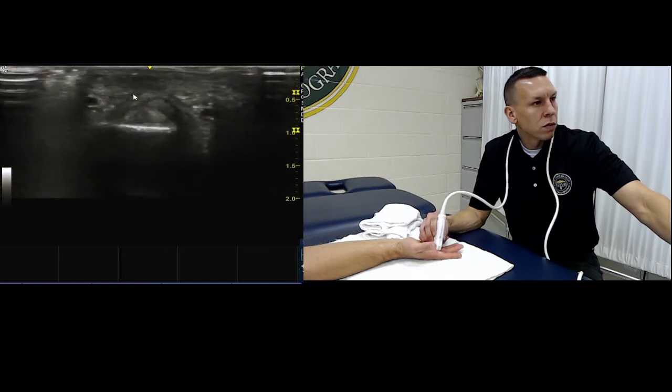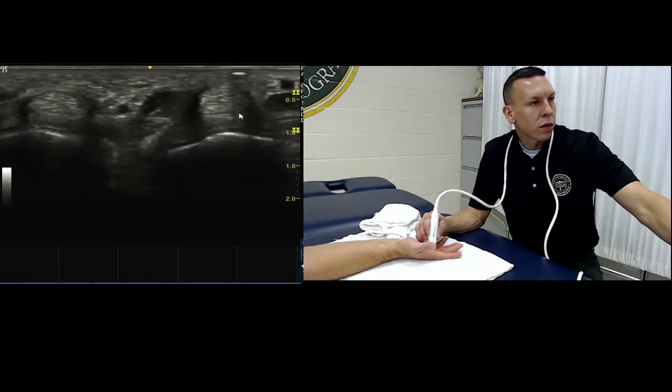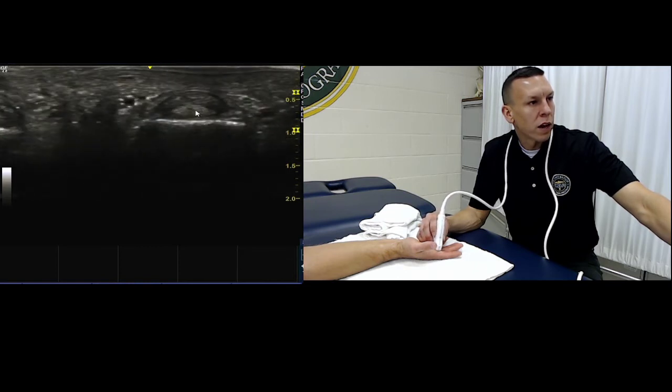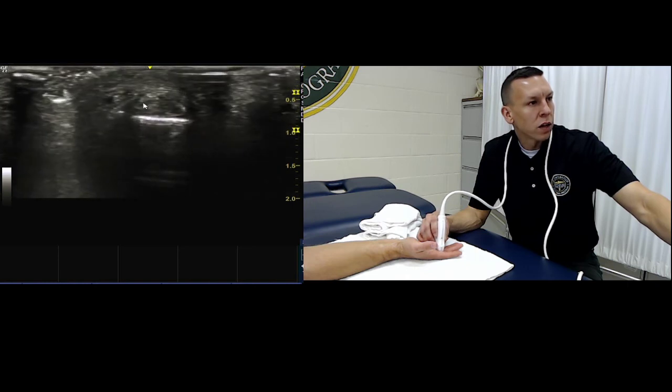Let's go back here. We'll do that again. Here we see the two, right above each other, 1 and 2. They're going to smash together. This one you can see the superficialis splitting, coming out to the sides.